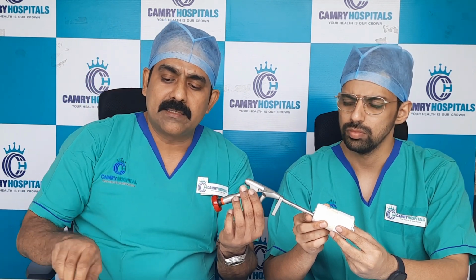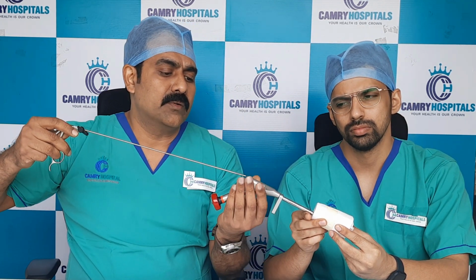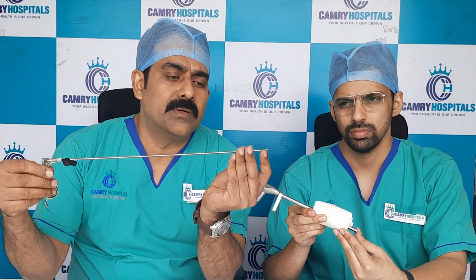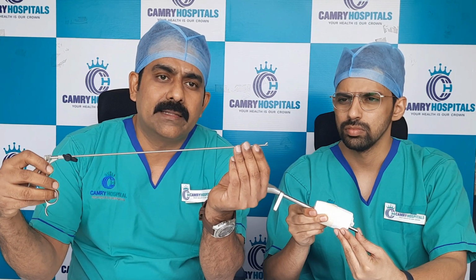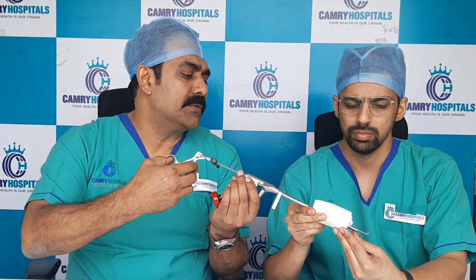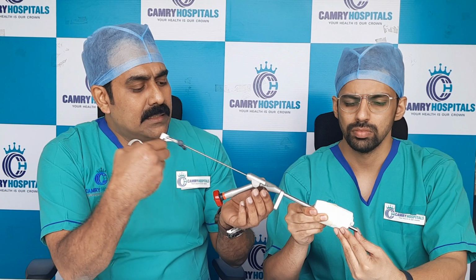Then we have precise instruments for this. Around 50 to 60 instruments are there, and this is called a grasper, which we can take inside. Once we see the whole thing, we see the tissues and the instruments. These are 3 mm or 3.2 mm instruments, very sturdy but very thin. These are all precisely made instruments imported from Germany. When it goes inside and the tissue comes, we handle the tissues with the instrument. So we can pluck out the bulging disc and just take it out.